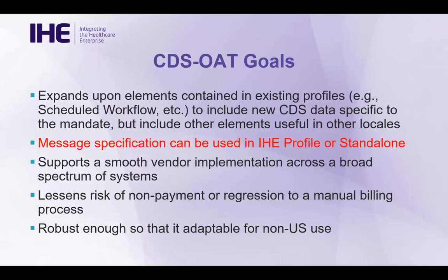We just published a new version this year that captures the new information with the new specification of the OBX segment. And we added a new tag specifically saying that for systems that use CDSOAT as a workflow profile, it uses all the transactions in Scheduled Workflow with the addition of the OBX segment. That's great, that's one approach.